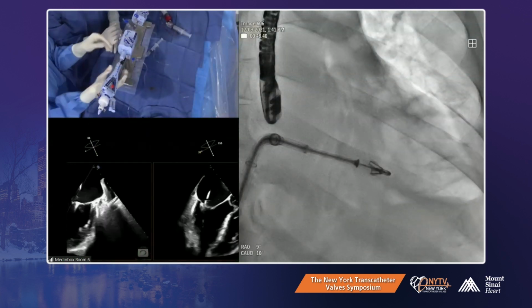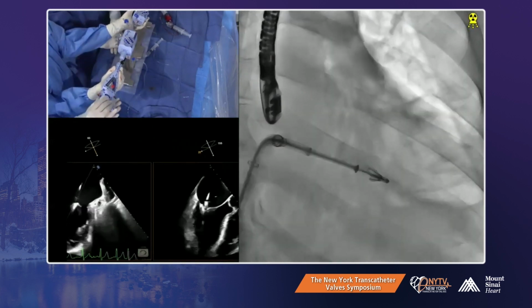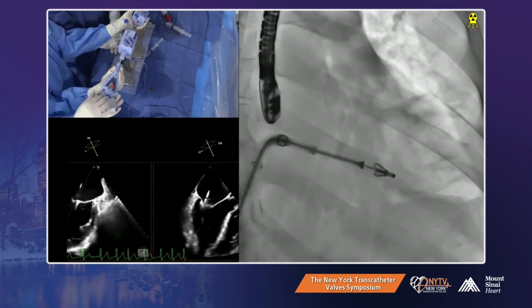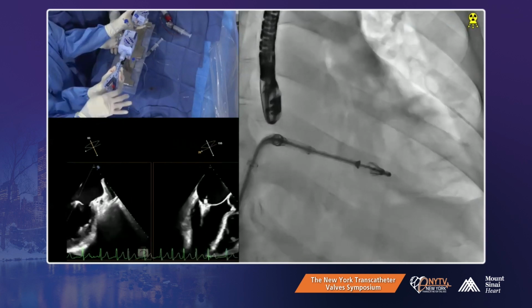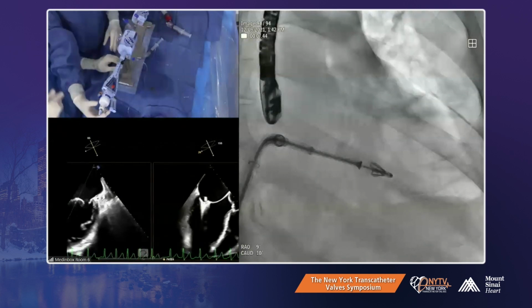Can you go live, please? Okay, we're going to close to 60 now, right? Okay, lock, please. That's the most central insertion you've had. Check orientation. Check insertion before we close.